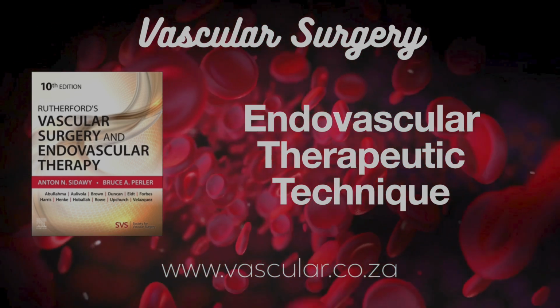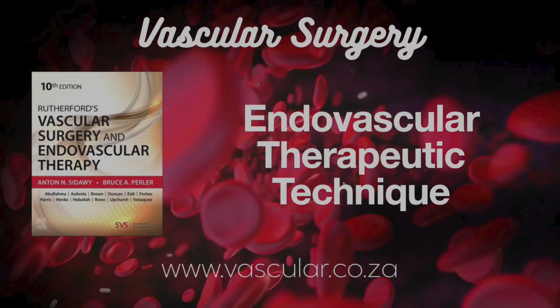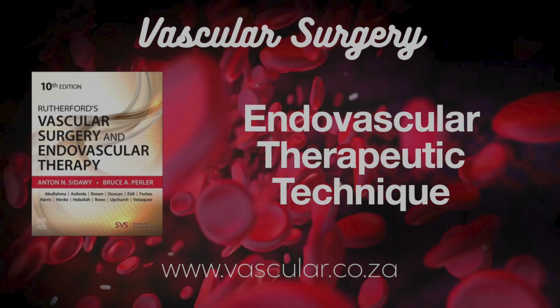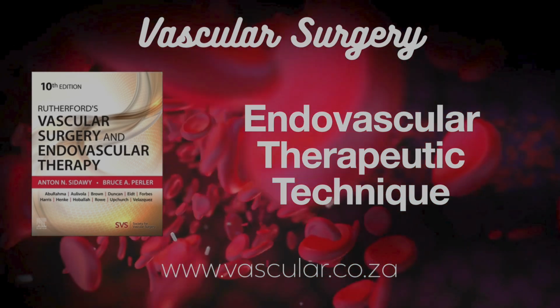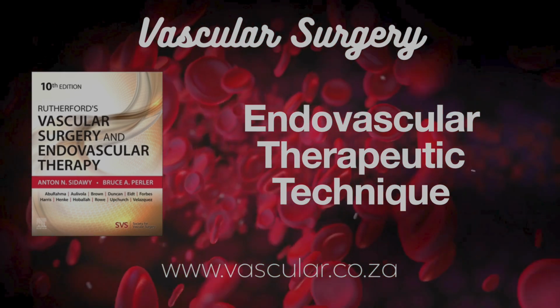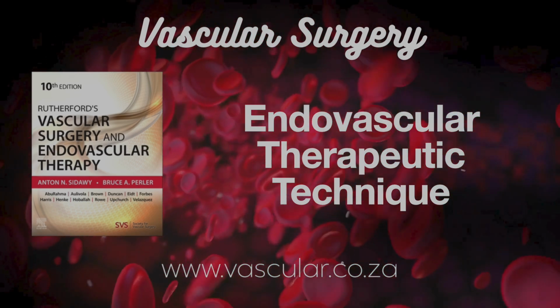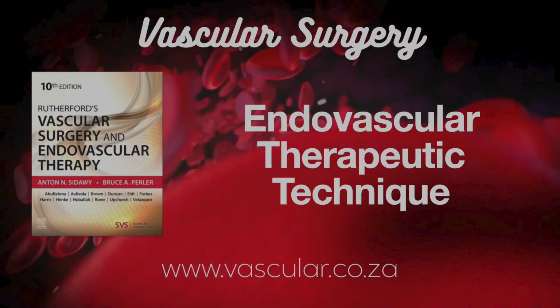Yeah, and then later, Gruntzig and Kumpe developed the actual balloon catheter, the kind of precursor to what's used now, polyvinyl chloride balloons, flexible. So when that balloon inflates inside an artery, what's actually happening to the vessel wall? Okay, so the main mechanism is something called blunt dehiscence. It sounds a bit aggressive, but essentially the balloon's force causes a controlled fracture and separation of the inner layers. The intima and media? Exactly. While at the same time, it stretches the outer layers, the media and adventitia. It's basically physically widening that narrowed passage.